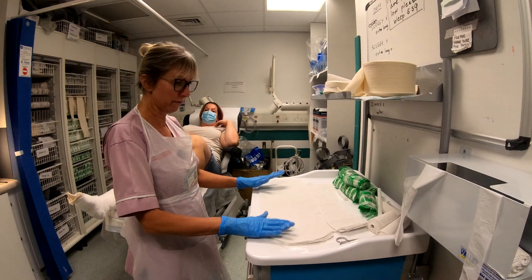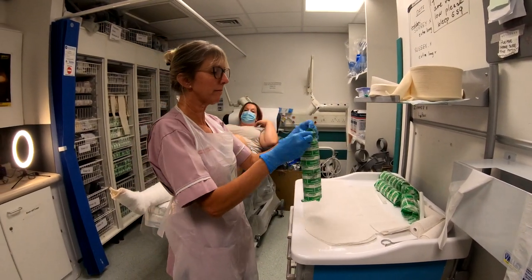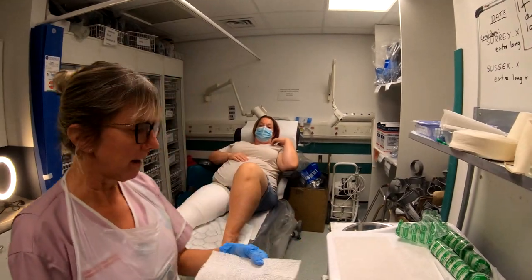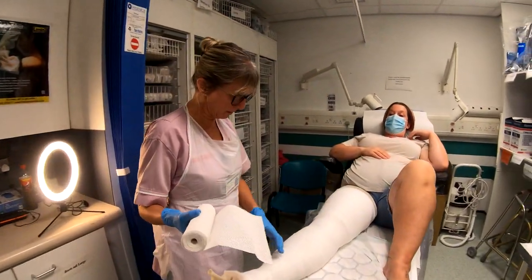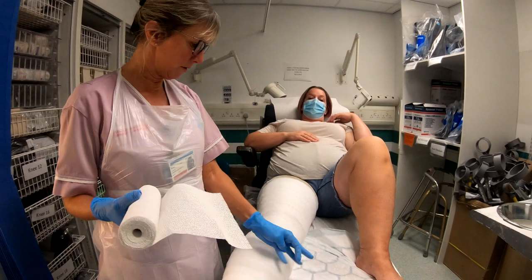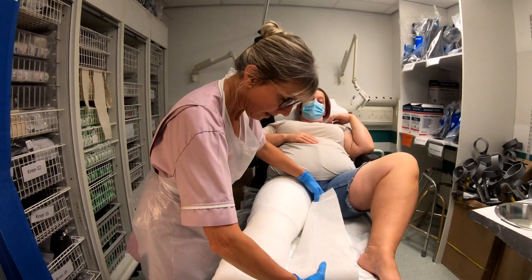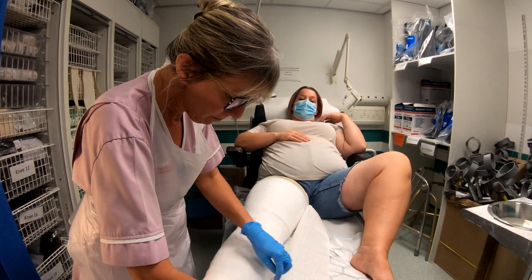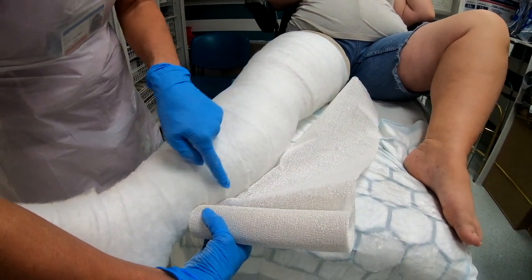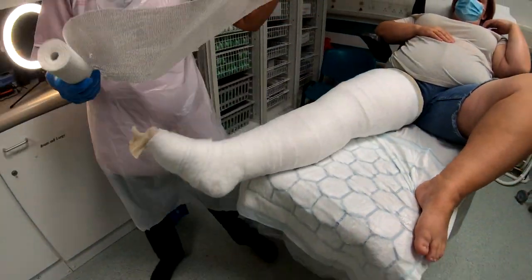Now we need to cut out for the above knee. We're going to use the 20-centimeter plaster — the widest. The most important thing to remember with the above knee, because of deep vein thrombosis, is that we mustn't stop anything in mid-calf. To protect that, when you measure the above-knee piece, you measure from a couple of centimeters lower than the soft band and measure past the calf muscle — make sure you've completely gone past the muscle and stop just below it. Stopping right in the middle of the calf would be dangerous.